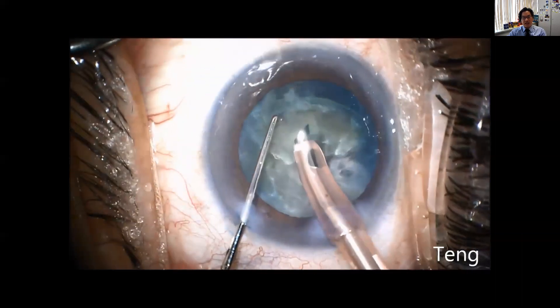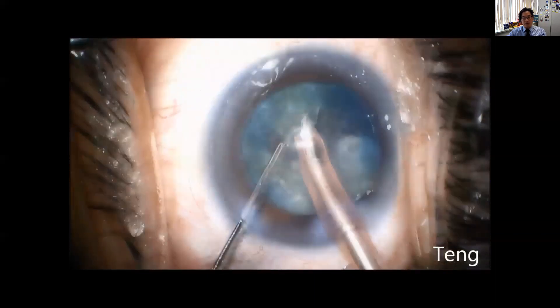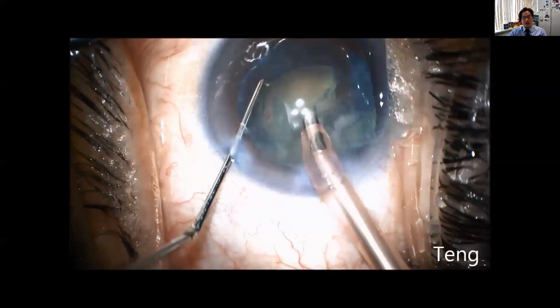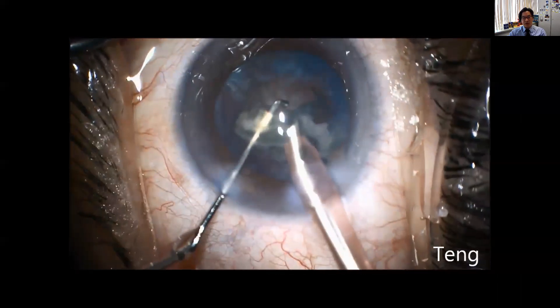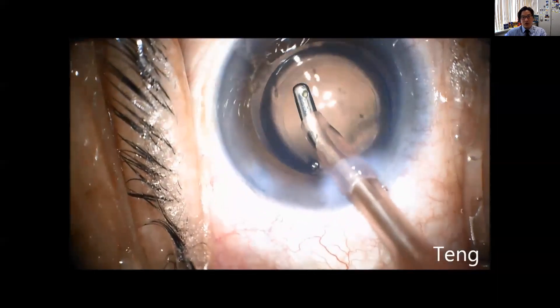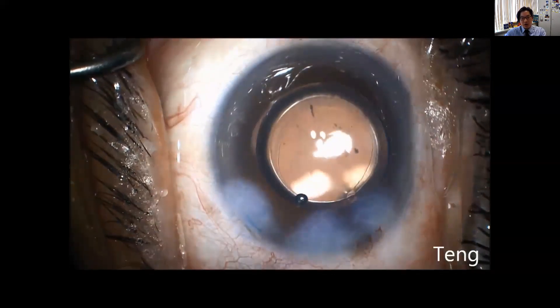Each step begets the next. You can step down a little bit if you want to pull the piece towards you, or you could reach around without stepping down as well. You can throw in some mini chops to complete the case. This is a relatively straightforward procedure. There are some pitfalls with the second instrument — you want to make sure you get under the capsulorhexis, reach up and over, then tilt down a little bit so you don't scratch the top surface, otherwise you won't be able to propagate the chop. That takes a little getting used to.